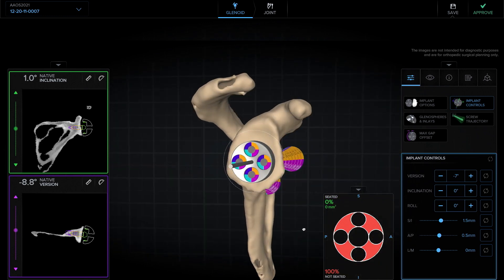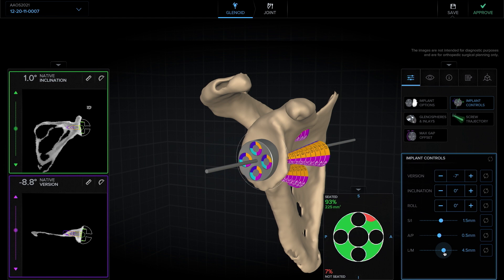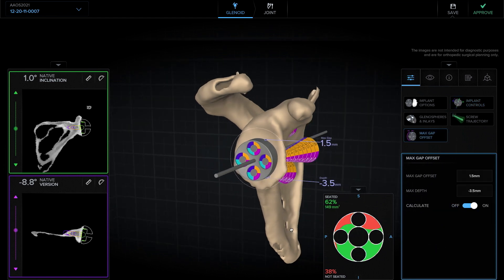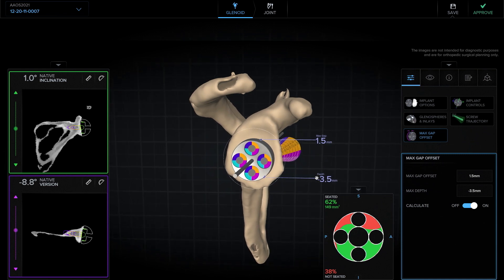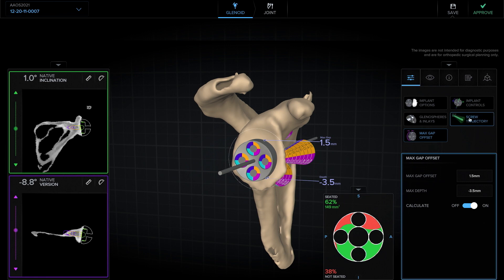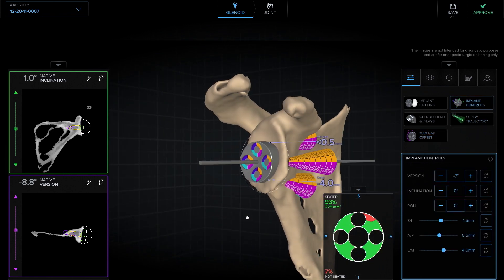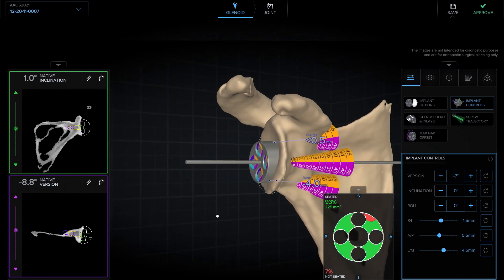Finally, we can adjust our depth and move it lateral or medial until we get good backside seating. I'm shooting for close to 100% backside seating, but I'm not necessarily committed to 100%. I often like to pair this with the max gap offset so that I'm balancing the amount of bone that I ream with the amount of backside seating I can achieve. We would then proceed to using the screw trajectory feature to choose the length of our screws and the angle for our non-locking screws.